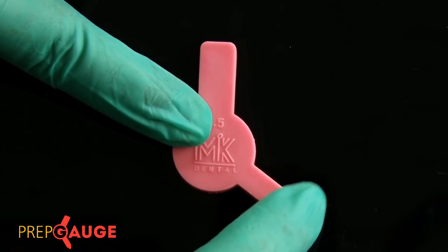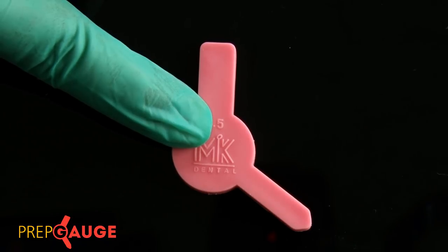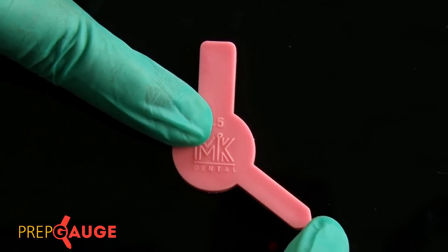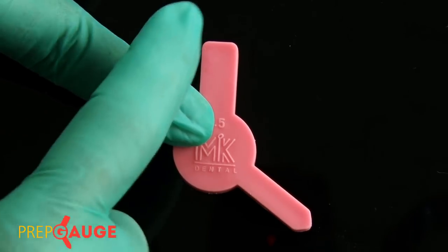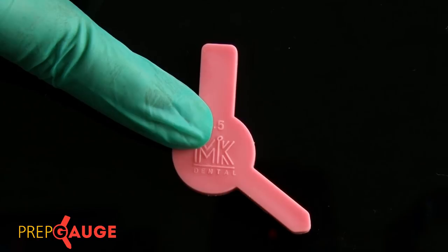There is also an extension that is slightly less wide — about 7 millimeters — which is ideal for use with maxillary lateral incisors and all premolar teeth. There is a small tip extension that allows the same gauge to be used for mandibular incisors, which are essentially the smallest teeth in the oral cavity. This means the very same gauge can be used to check clearance on all teeth in the oral cavity with utmost comfort.